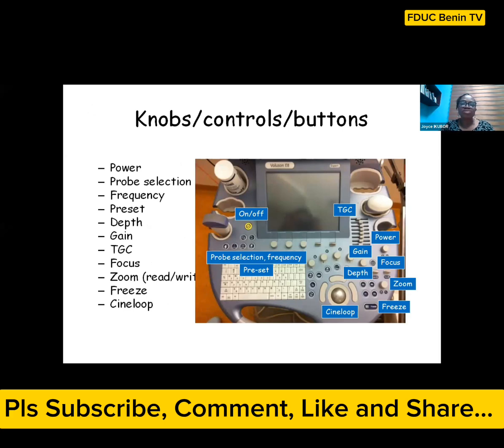Okay. First of all, before you start, you have to put on the machine, but the machine has to be connected to an electrical source. I'm sure yesterday during the lecture on physics, Dr. Ikubor spoke to us about the fact that the electrical energy has to get into the transducer, excite the piezoelectric crystals inside. So if you don't put on your machine, if it's not on, then you cannot even start to scan. Then the next thing you want to do is to look for the probe selection.